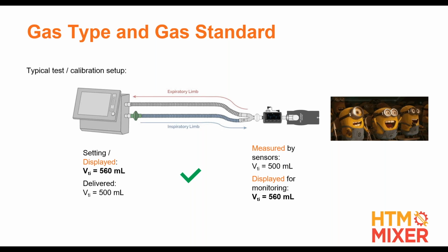So yeah, keep that in mind. I always have like 5 different things I tell people when they're troubleshooting. It's like, is your analyzer warmed up? Did you zero it out? Have you set the gas type and the gas standard correctly? That takes care of like 90% of the problems. Because as soon as they go through those things, they go like, hey, oh, wow. What did I say? 5? Warmed up, zeroed out, gas type and gas standard.